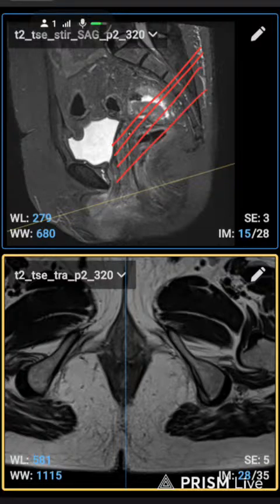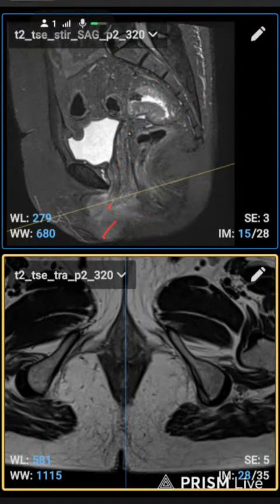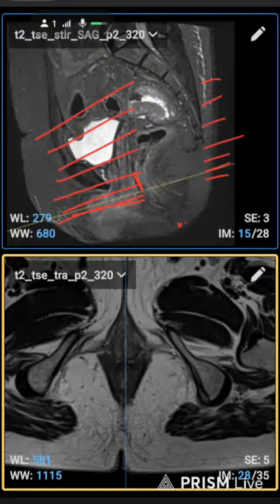If I plan that type according to the tumor, it's not showing properly in the rectum, it's showing oblique. So we will plan the sequence according to the rectum. The rectum goes this way, and we can take the 90-degree axial cut of the rectum. So everything will appear like normal anatomy.